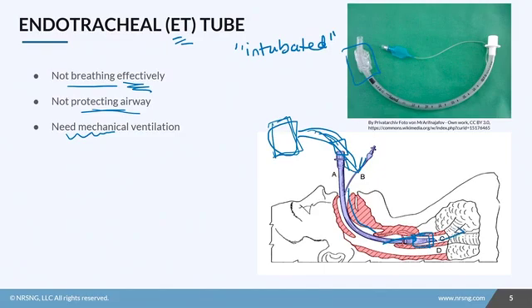So when we push all that positive pressure in here, if this balloon isn't inflated properly, all that air is just going to come right back out. So we leave that inflated. Now the blue thing you see here, this tube coming off here, that is your balloon port.